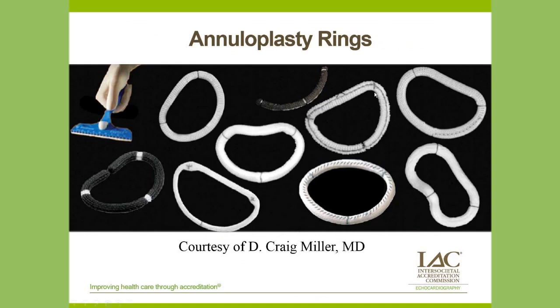The white hats are good guys. They're complete rings, rigid rings or semi-rigid rings. Incomplete rings or posterior bands are black hats. They're the bad guys. And Craig Miller is a very famous cardiac surgeon at Stanford. He gave me this slide. By the way, he also says, if you don't have a ring named after you, you're not a notable mitral valve surgeon.